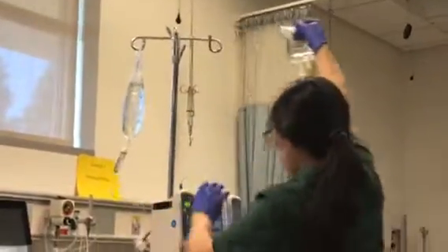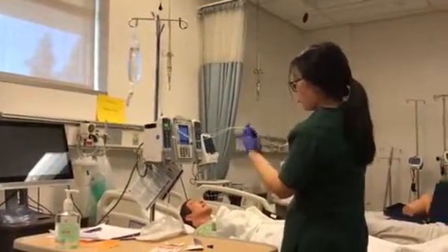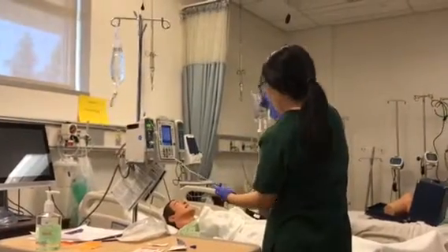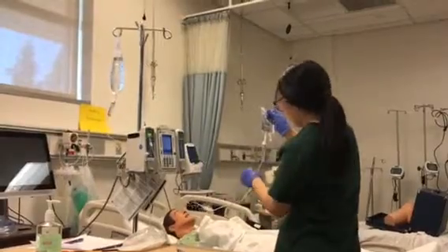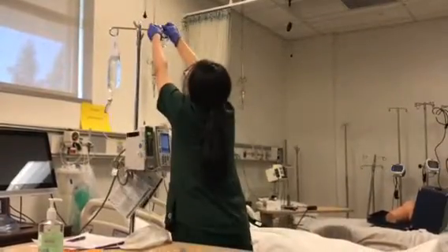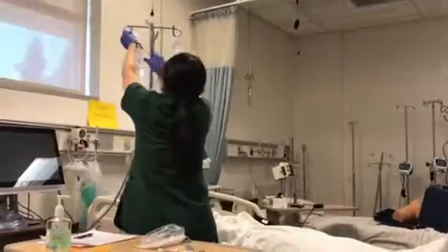Then I will do the back priming here. Make sure there's no air bubble. I will open the clamp, and that's the primary workflow here. Okay, now it's all bubble free. I'll go ahead and hang it here and then use this one. Go ahead and lower the primary bag.